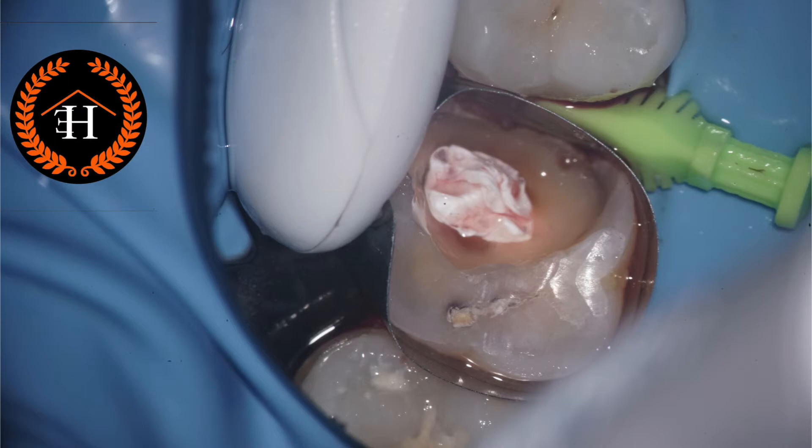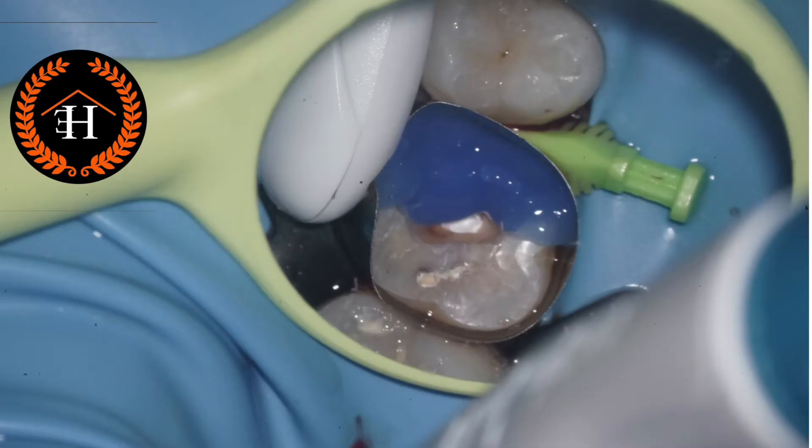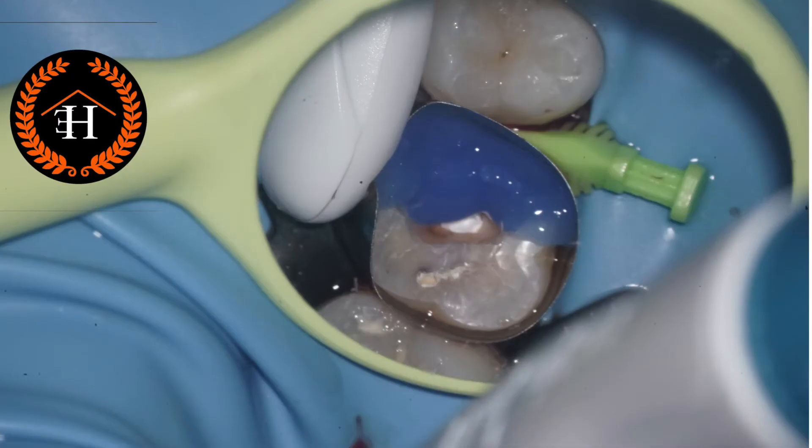For restorative use, sometimes you can use pre-contoured or pre-curved matrices. After our regular isolation, etching, and bonding protocol, I used a thin layer of flowable composite followed by a packable composite to create that missing wall.